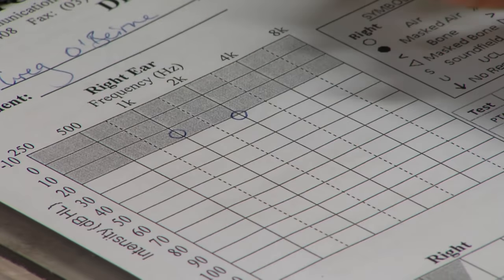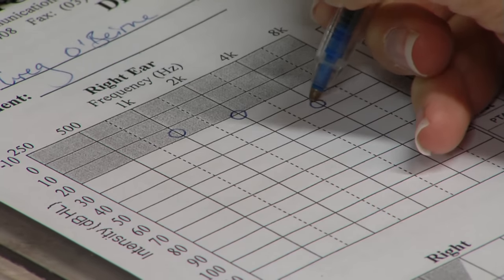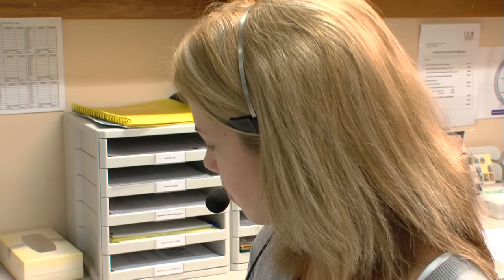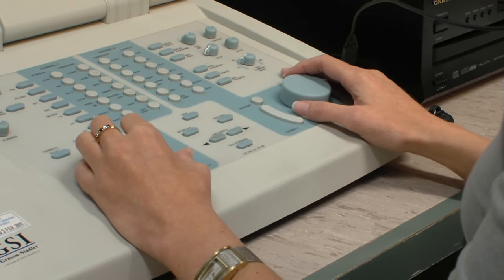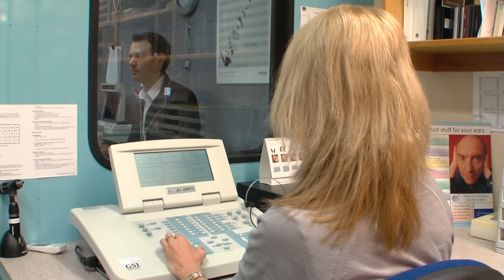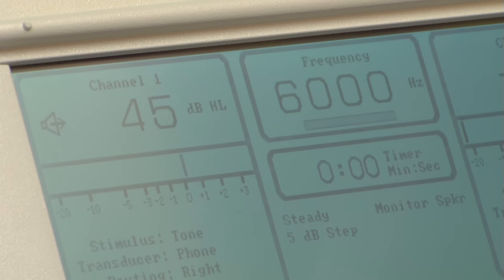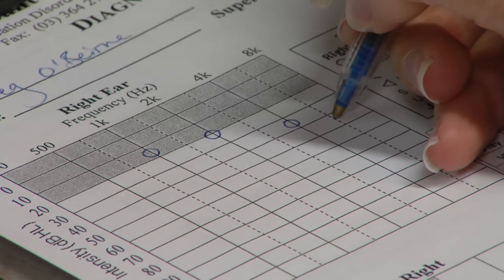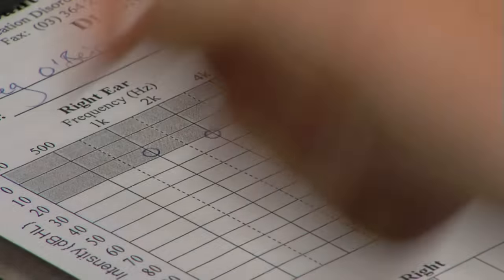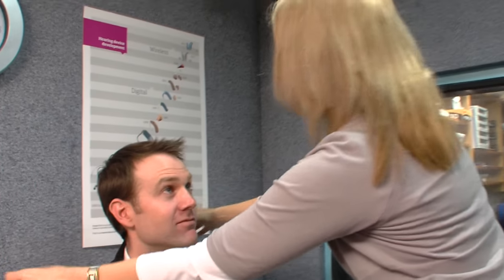On the audiogram, the thresholds are recorded as crosses for the left ear and circles for the right ear. Air conduction thresholds reflect the integrity of the total peripheral auditory mechanism. It's not possible to determine the location of any pathology along the auditory pathway using air conduction alone. Therefore, if a hearing loss is detected, further testing is carried out using bone conduction testing to help establish the site of lesion.